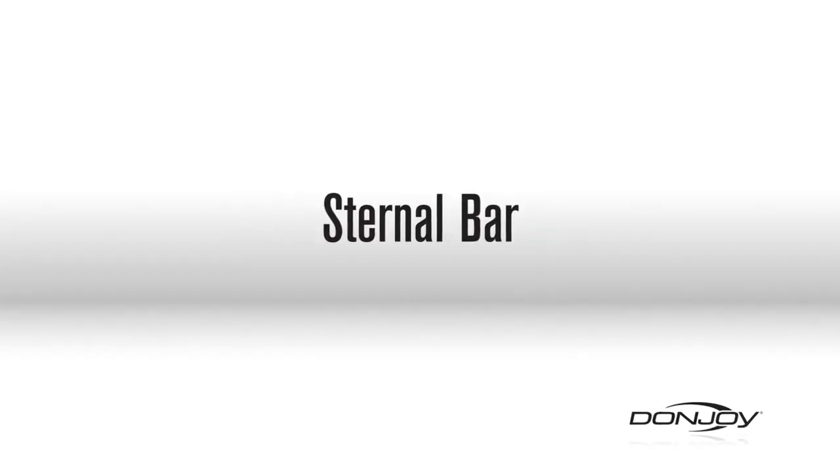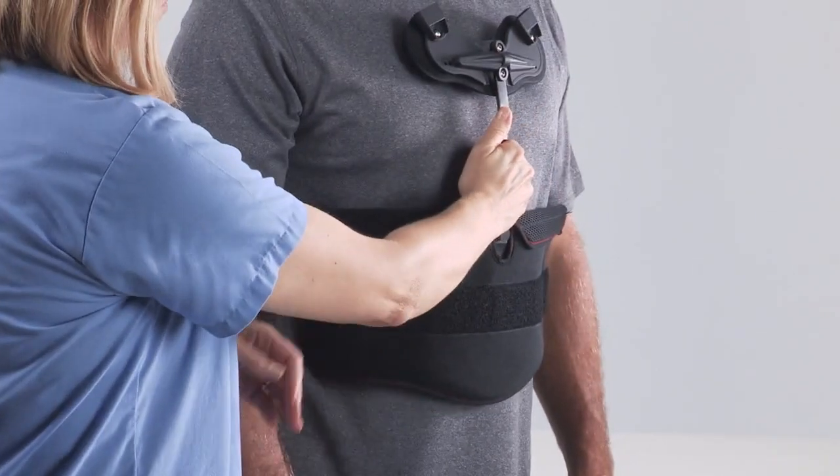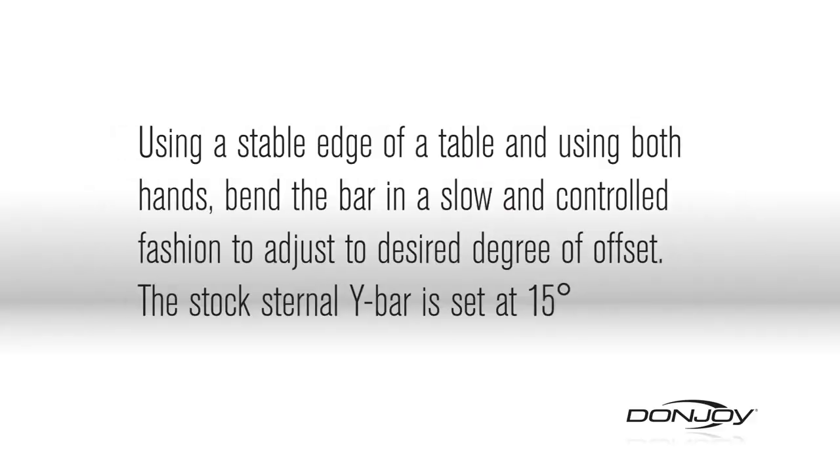Sternal bar. The sternal bar may be bent as needed by using a stable edge of table. Using both hands, bend the bar in a slow and controlled fashion to adjust to desired degree of offset. The stock sternal Y bar is set at 15 degrees.